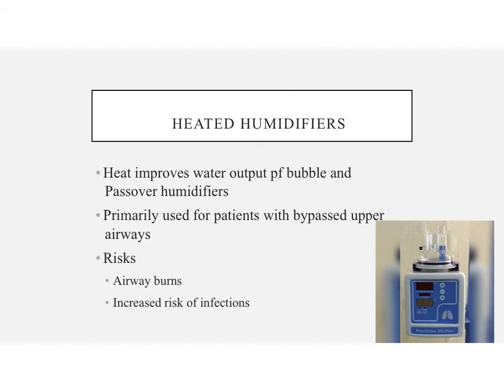We do risk airway burns if the temperature becomes too hot or if RT or nursing is not paying attention and the humidifier runs out of water and that air is just dry and hot. And we increase risk of infections because we're adding heat and water. If we get condensation in the tubing, then we risk bacteria colonizing and getting into the airway and causing further infections.